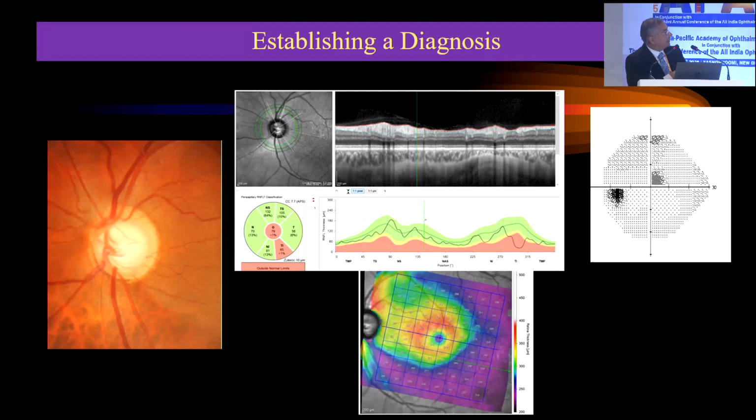Now, this is just to show you how we typically use OCT to diagnose glaucoma. We look at the nerve fiber layer thickness measurement, and we look at where there is a pinch. If it is early glaucoma, almost always the loss is in the superotemporal or the inferotemporal areas. And you can see where it dips into the abnormal, but you have to make sure that it is corresponding to that. And then, of course, the average thickness will be lower.